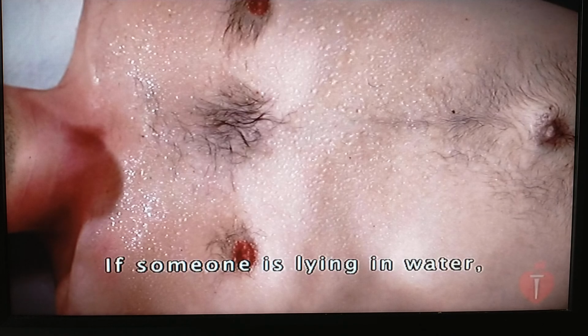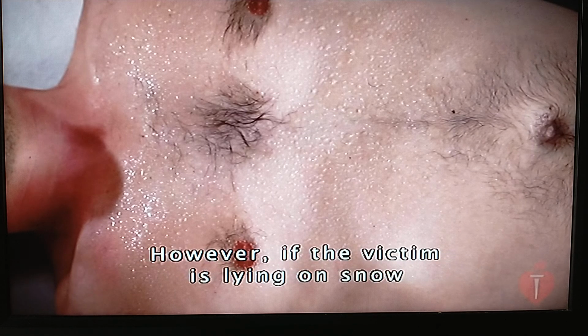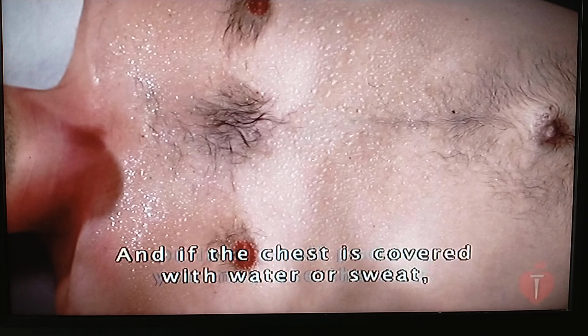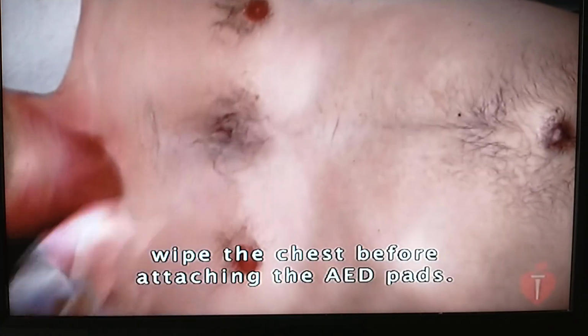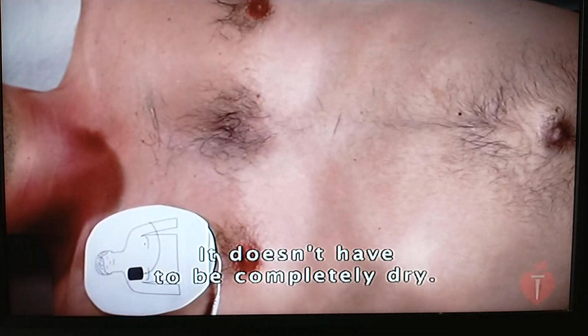If someone is lying in water, you should quickly move the victim to a dry area. However, if the victim is lying on snow or in a small puddle, you may use the AED. And if the chest is covered with water or sweat, wipe the chest before attaching the AED pads. But wipe the chest quickly. It doesn't have to be completely dry.